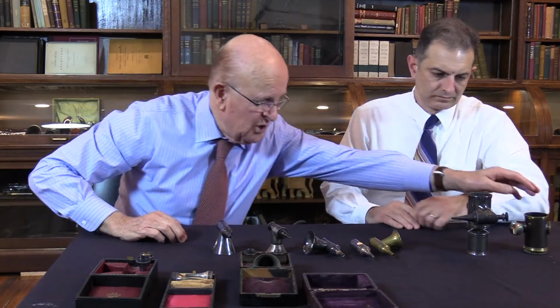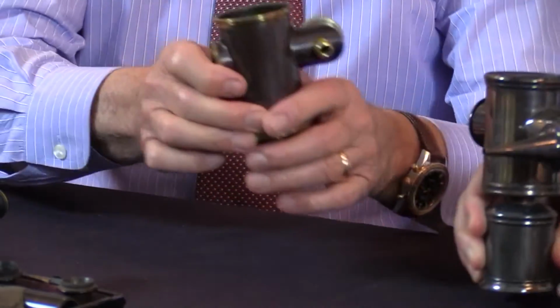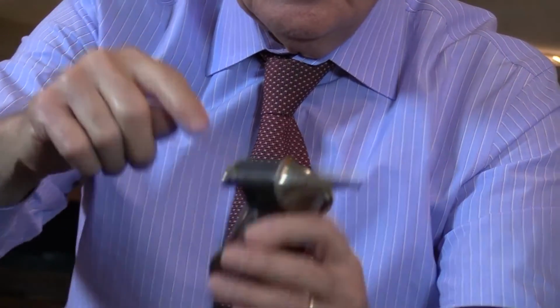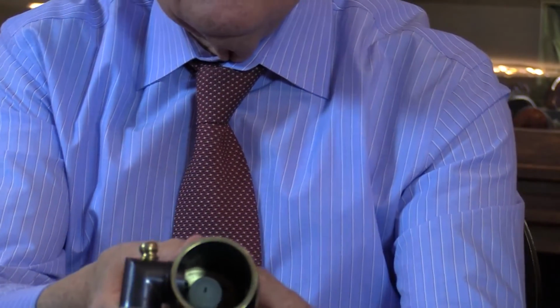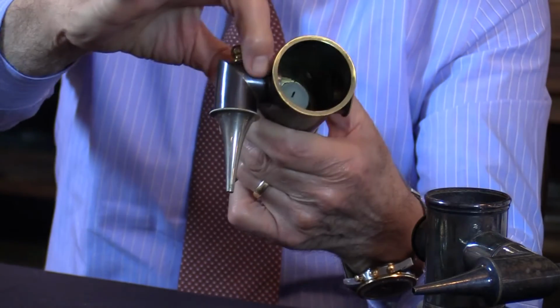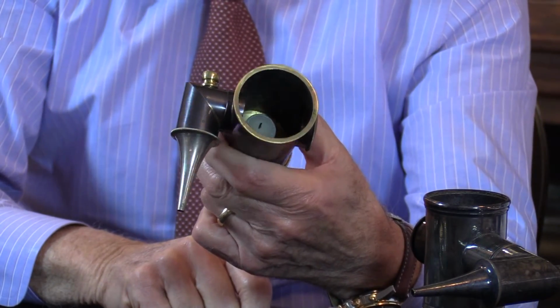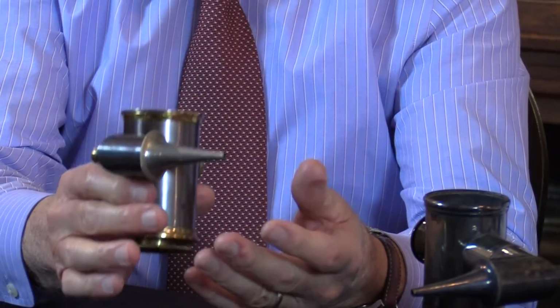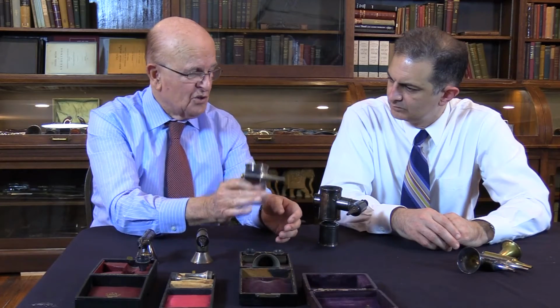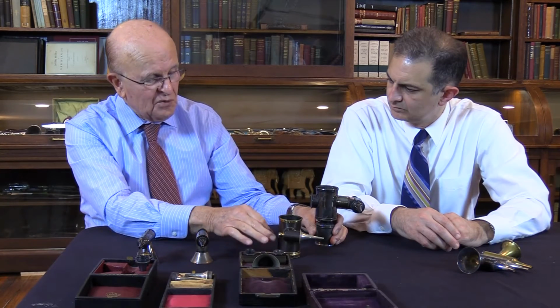So there were people that said, well, let's do something about it. And we are fortunate here that we have a couple of these devices where, as you can see, this is a typical Clark ear speculum. However, this is a 45-degree mirror here, but what they have here is a candle. So you can light the candle, and the light will go through this tunnel here, hit the 45-degree angle, and reflect the light to the front, towards the eardrum. So this is the first one where everything is enclosed: the light source, magnification, and everything. That's one of the earliest ear examining devices. They used to call it the self-lit otoscope.